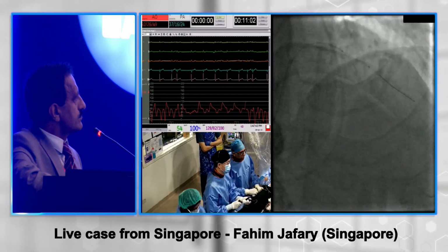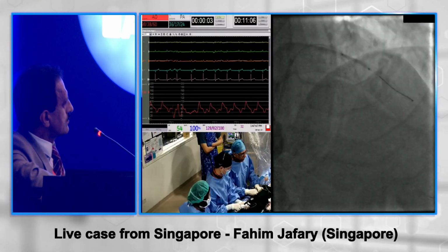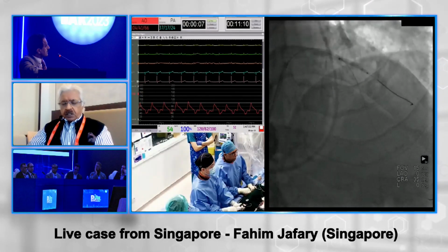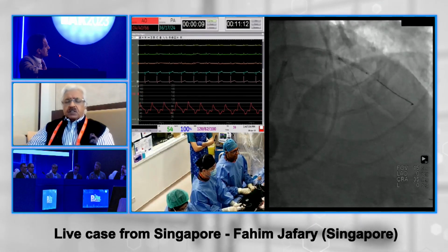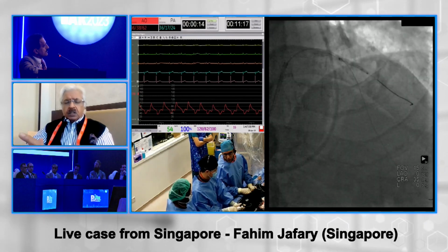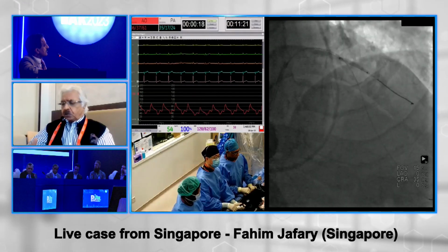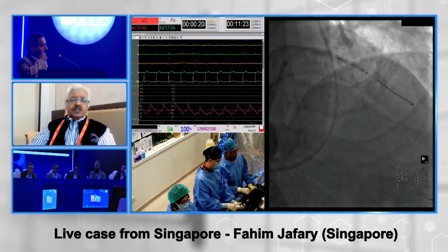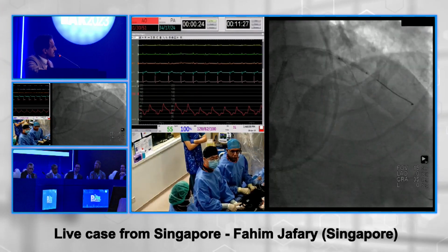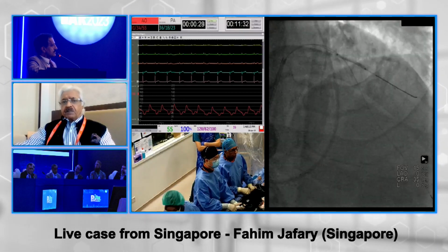May I comment on this? I support the dilatation of the diagonal. You may say this is diffusely diseased, but you certainly want it open and you don't want it closed at the end of the procedure. The second thing is I support that, whether you use a cutting balloon or something else, you need to modify the lesion prior to the drug-coated balloon. With a cutting device, efficacy is better. And finally, it prevents diagonal closure.